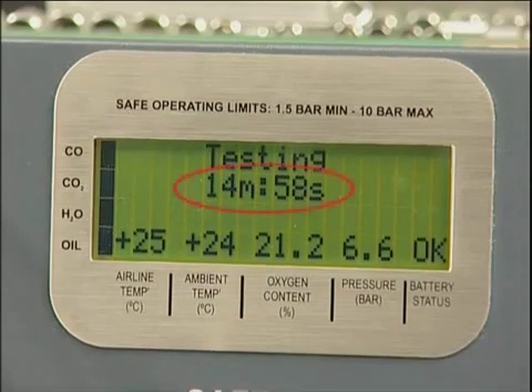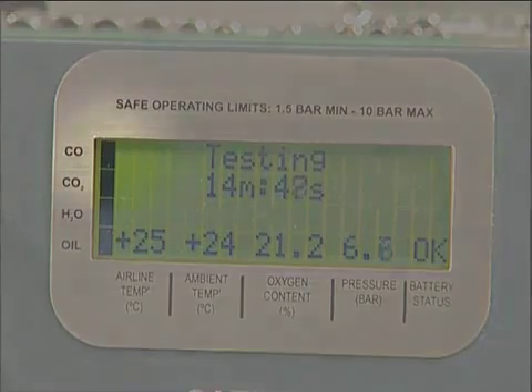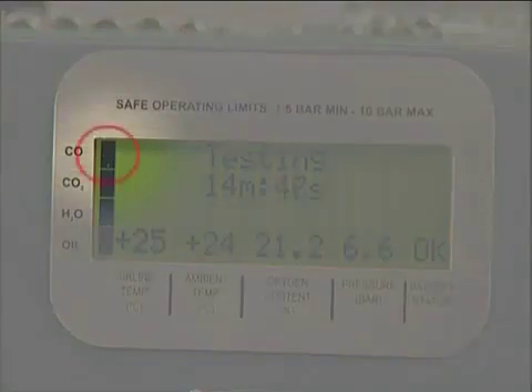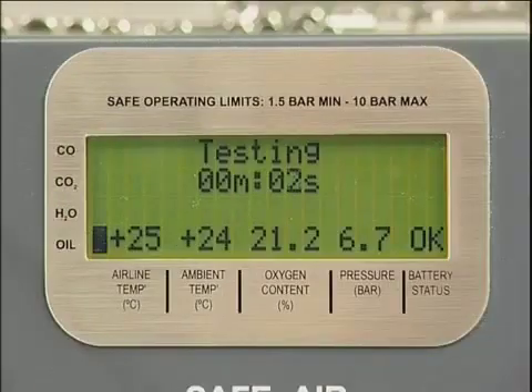The duration will be displayed as a countdown together with airline temperature, ambient temperature, oxygen content and pressure. The status of the individual tests is indicated on the left hand side of the display. Black indicates test active and clear indicates test completed. The unit can be left until the test time has elapsed.